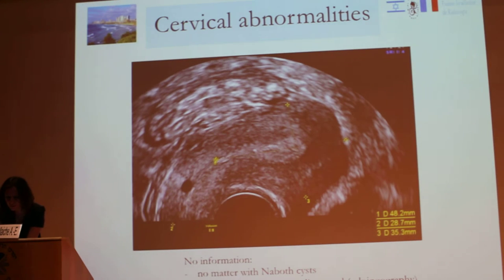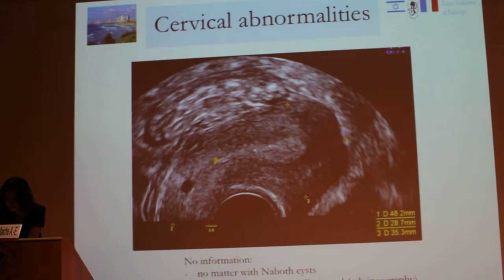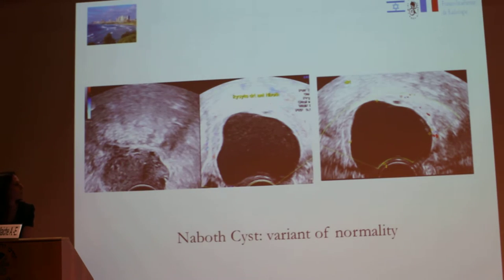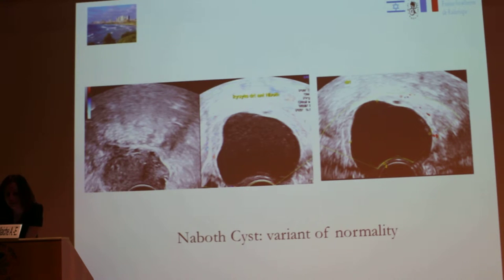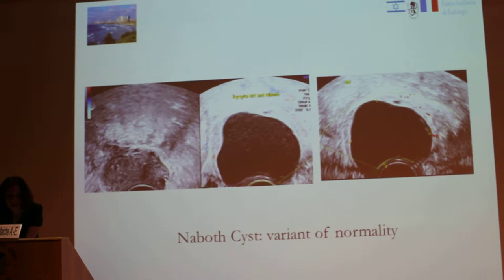Here you have an example of ultrasound imaging. There is an example of Nabothian cysts, and it is not a problem — it is not a cause of infertility. We can note there is a stenosis of cervical structure, but that is not a problem. MRI and ultrasound are not good exams to explore cervical stenosis.